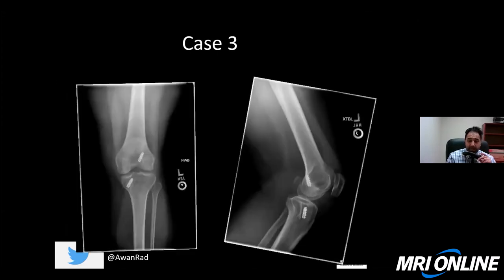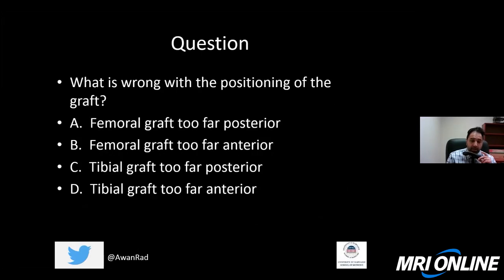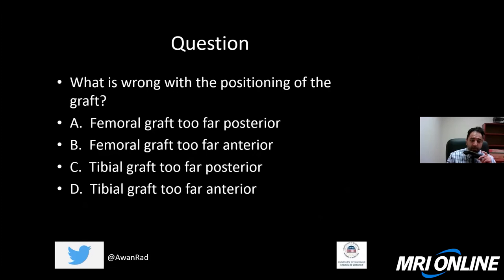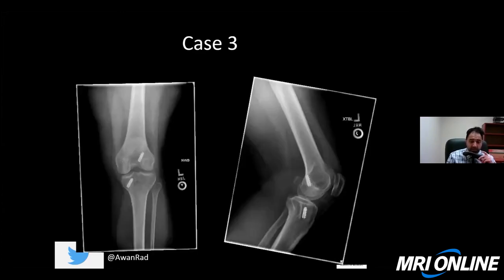Question number three: this is a patient that's had an ACL repair, as you can see with the interference screws, and there is an abnormality. We have AP and lateral radiographs of the knee. What's wrong with the positioning of the graft? Is it that the femoral graft is too far posterior, the femoral graft too far anterior, the tibial graft too far posterior, or the tibial graft too far anterior?